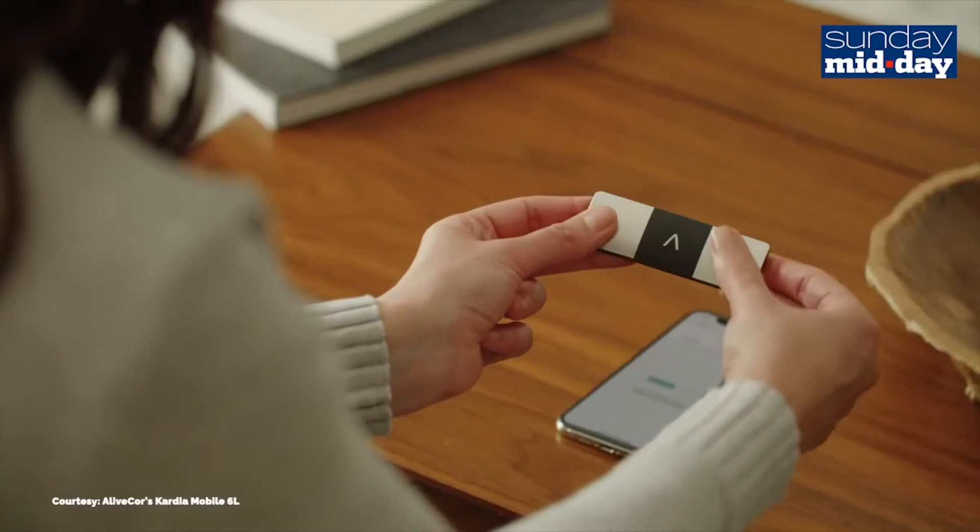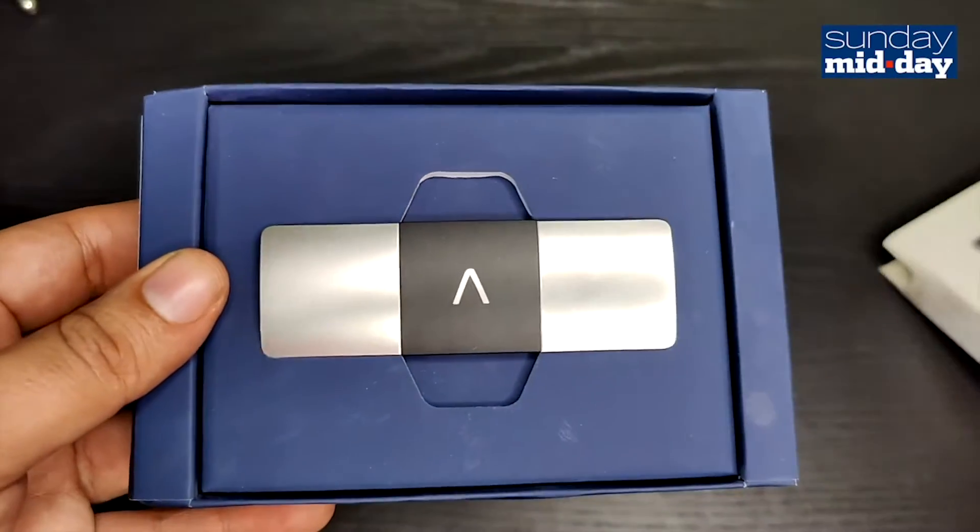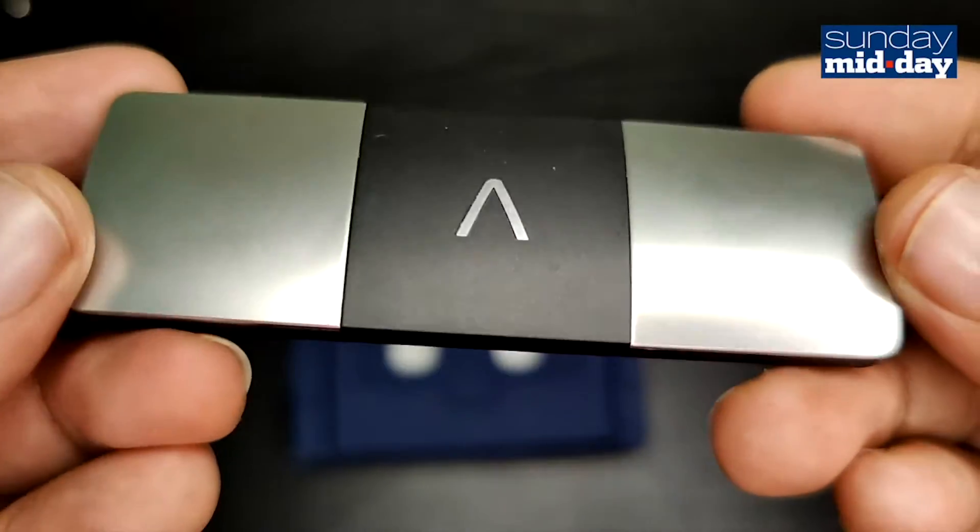All you have to do is touch it. In the box you get the device — it has 3 metal leads, which are to be used to check your EKG.